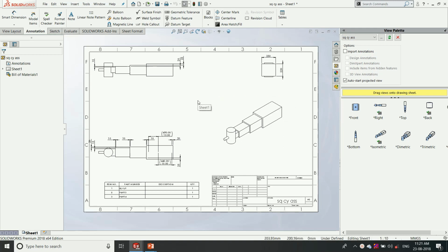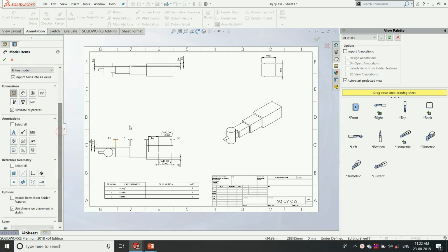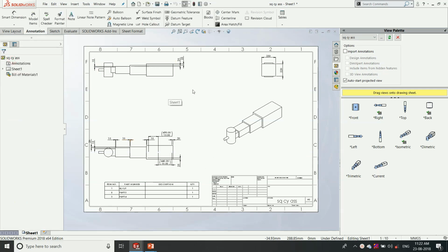Once we choose the drawing views, we can give model items, where the dimensions of the component will be automatically updated like here. Then the bill of material can be imported. In the list of tables we can choose the bill of material, which I have chosen here. In this assembly component, these are the three bills of material, and when we are giving it to the manufacturer we can choose the quantity of each component, and we can also export this bill of material as an Excel sheet for further reference and data analysis.